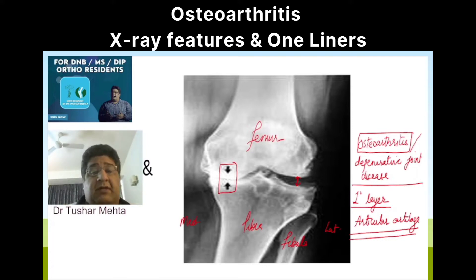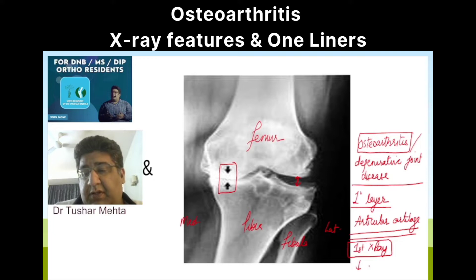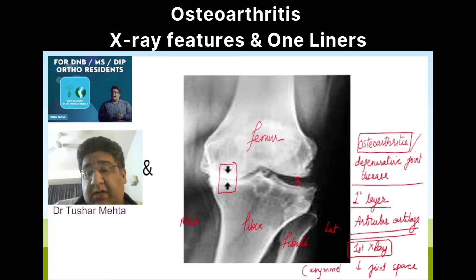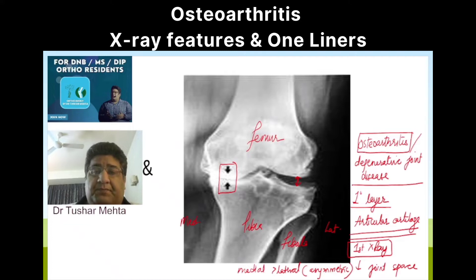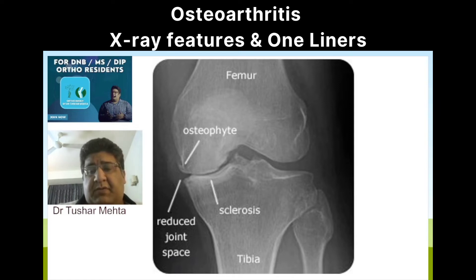We have to look at certain obvious radiological signs. The first X-ray sign, as you can clearly see, is reduction in the joint space. This reduction is an asymmetric reduction, where medial narrowing occurs earlier and more compared to lateral narrowing, which we can all see here.